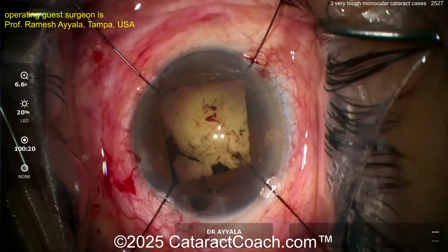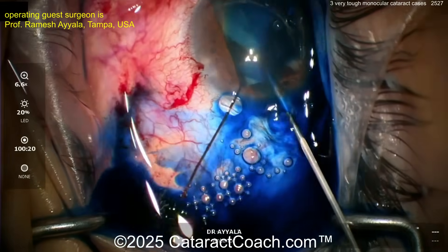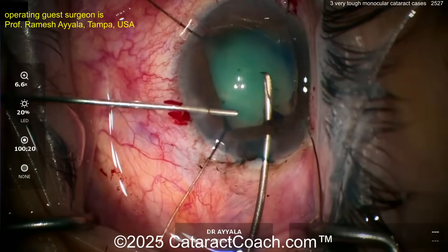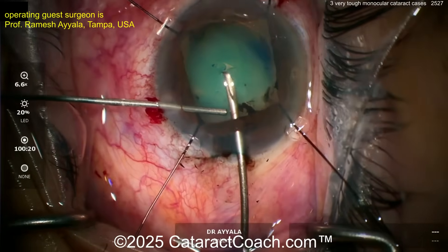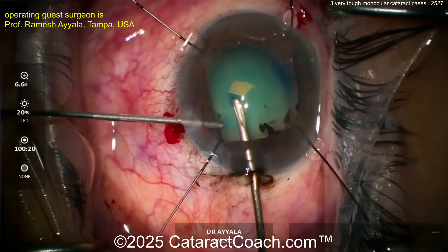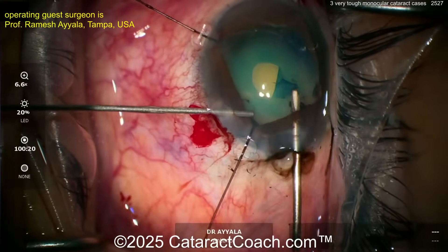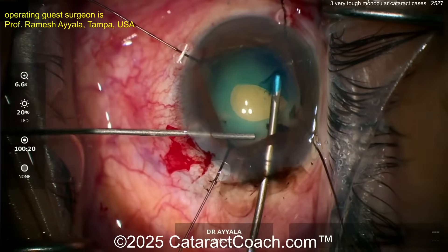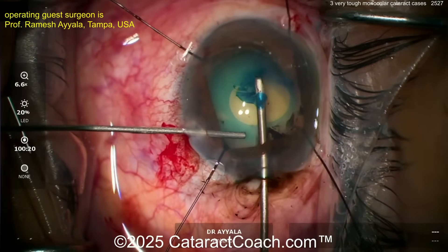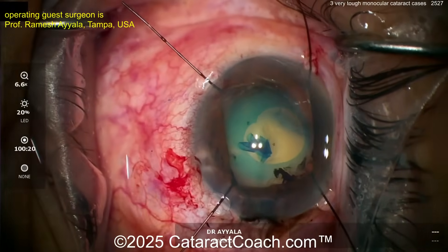Maybe inject a little viscoelastic. There are the iris hooks already in. The rhexis is going to be completed soon with a little bit of trypan blue dye. I like the idea of just painting on the trypan blue dye — you don't want to squirt it everywhere, because if there's zonulopathy and it goes into the vitreous cavity, you'll lose your red reflex. Now starting the rhexis — look how the left hand is injecting viscoelastic while the right hand uses a cystotome. That's a pretty dense lens and it's going to be a little challenging to get out.